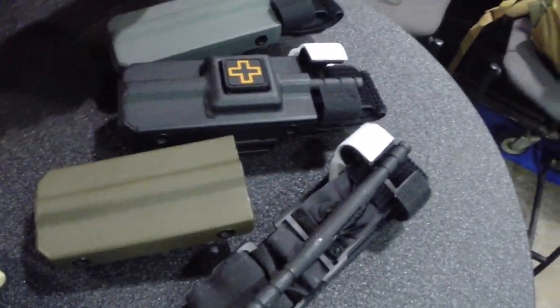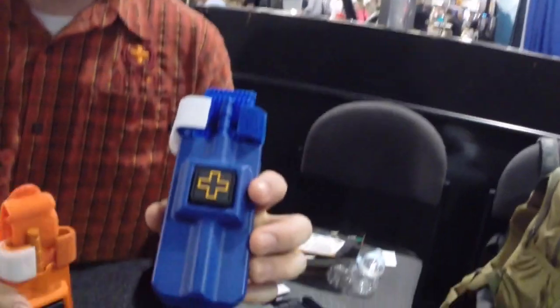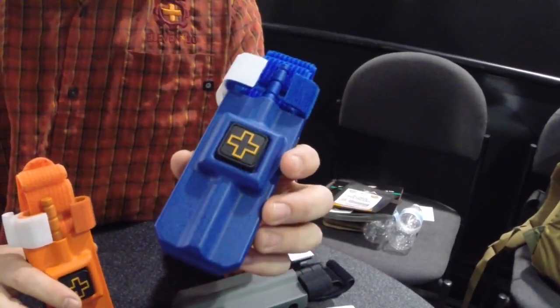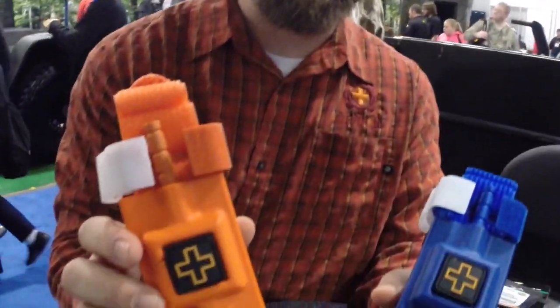Color wise: black, coyote, ranger green, gray. And we also have two new versions coming out — training blue. This way if you're an instructor and you don't want your tourniquet cases to walk away, you use blue because no one steals blue tourniquets. And we also have rescue orange.